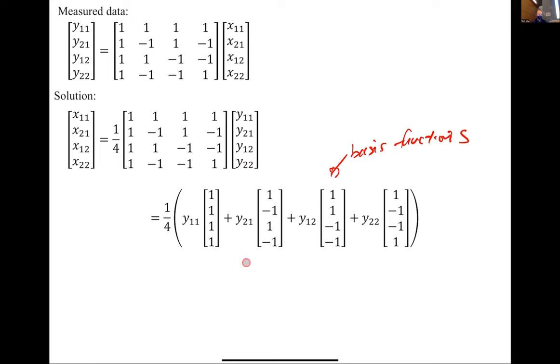If you remember back to your linear algebra, the idea is if you have a vector space, your image lies in some vector space. For example, if I have an n-dimensional image, let's say a 100 dimensional image, 100 numbers, then X belongs to the space of all possible numbers in a 100 dimensional space, which is a huge space. And that's the problem. We're trying to estimate these things in very high dimensions.